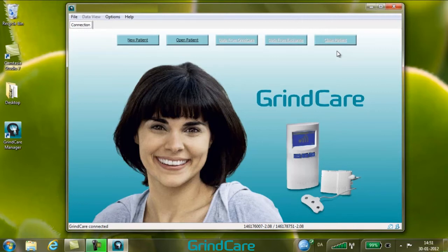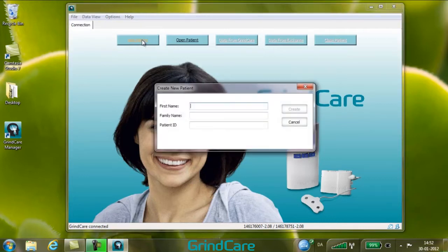To create a new patient file, click New Patient and a new window opens. Enter first name, last name, and patient ID, then click Create.